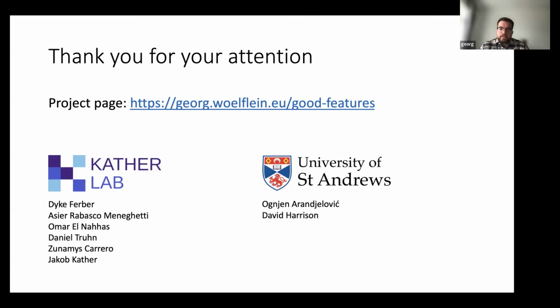So I think it would be feasible to leave it out, or at least whenever starting a project, just not do stain normalization. Maybe afterwards, once you've got a minimum viable product, see if you have the computational resources and whether adding stain normalization improves the results. But to just get something up and running, I think we're fair in not performing stain normalization.